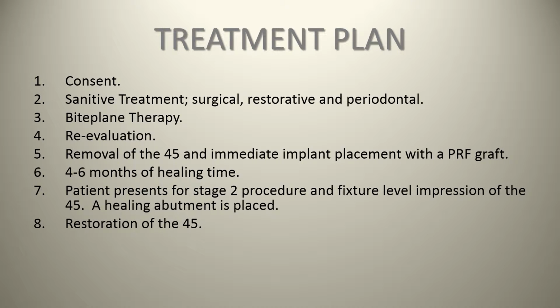And this is basically the crux of this case presentation. We're going through the entire case, but this video is going to be just about how to take this open tray fixture level impression. We're going through the whole case just to sort of give people an idea of how everything goes from gate to gate.